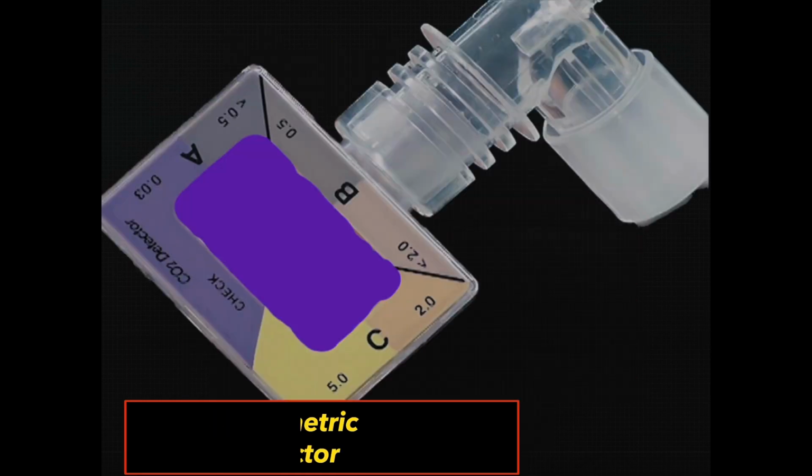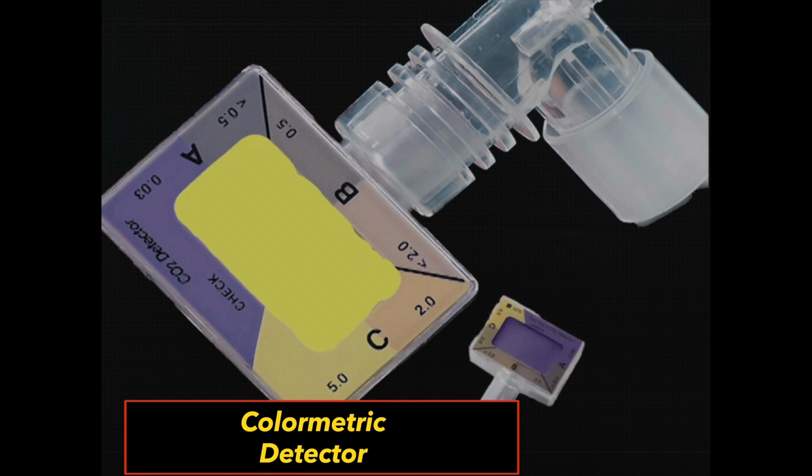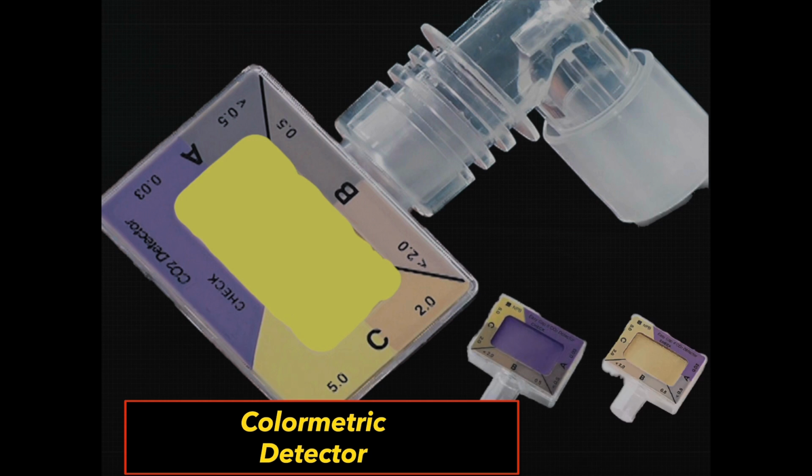Colorimetric capnometers. A colorimetric capnometer consists of a pH-sensitive impregnated paper that attaches at the end of an endotracheal tube. The color of the pH paper changes from a purple to yellow when the capnometer detects carbon dioxide. Colorimetric capnometers can be helpful in assessing whether or not an endotracheal tube placement has been successful. Also, when a patient is undergoing CPR, a colorimetric capnometer can be the first sign that the patient is attaining ROSC.